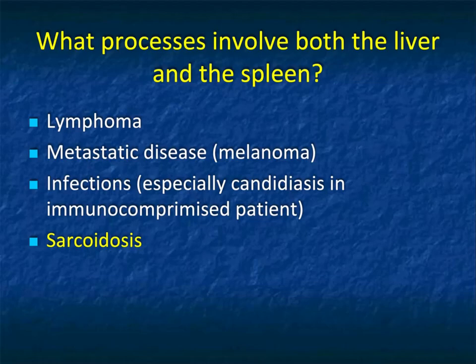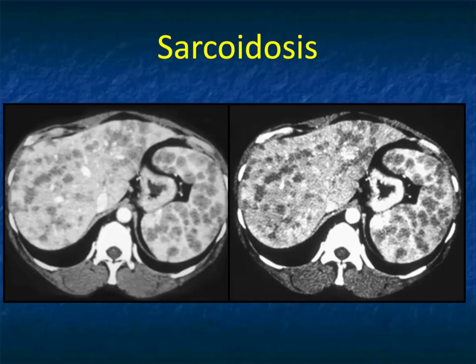It can be infection, particularly in an immunosuppressed host, where they get candidiasis or aspergillosis, usually in the spleen, but it also can involve the liver and potentially also involve the kidney. But again, the history. These are typically bone marrow transplant patients. And one thing to mention that's a great masquerader always is sarcoidosis. And I always get this case sent to me every couple of years. It used to be more frequent, but maybe because we spoke about it, people recognize it themselves.